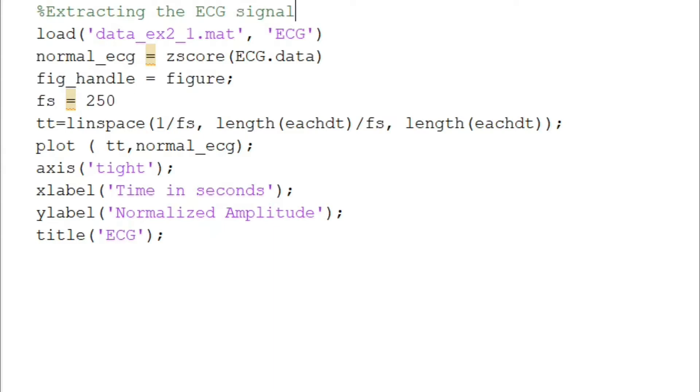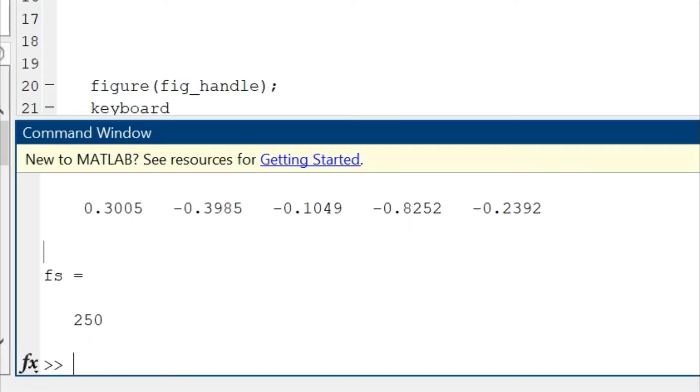Now I am going to normalize this signal with a simple function called zscore. You can look into what zscore actually does by simply typing help zscore.